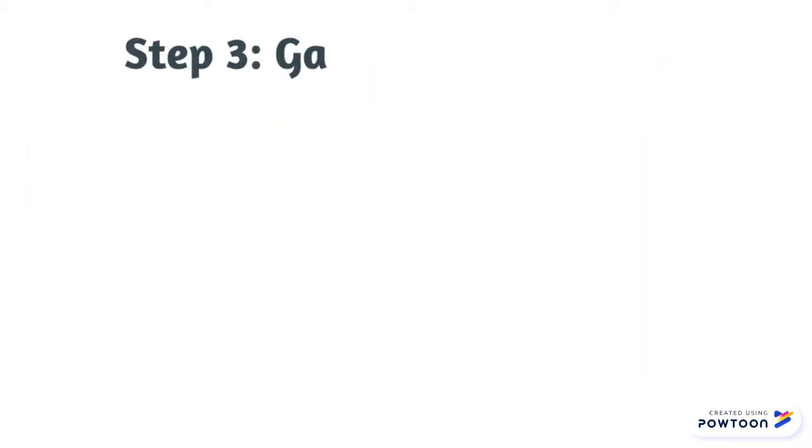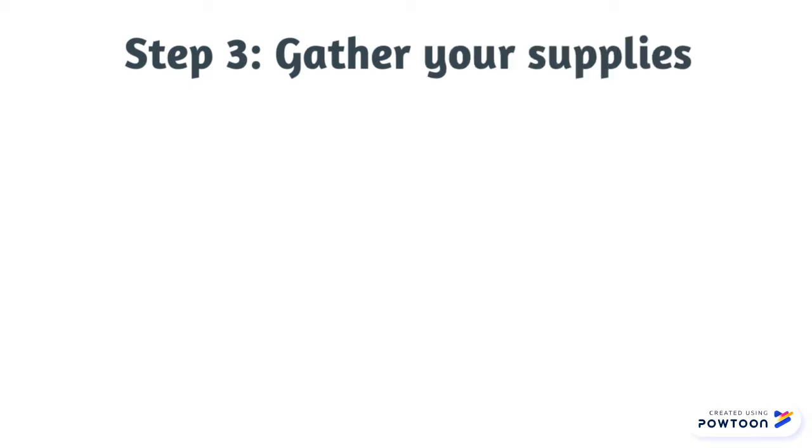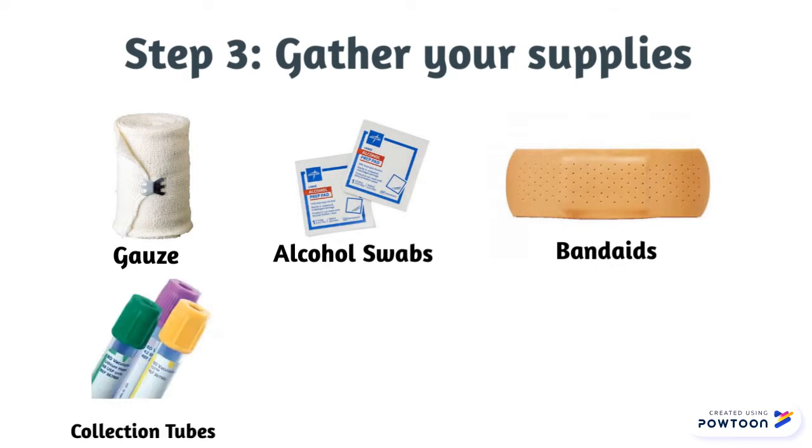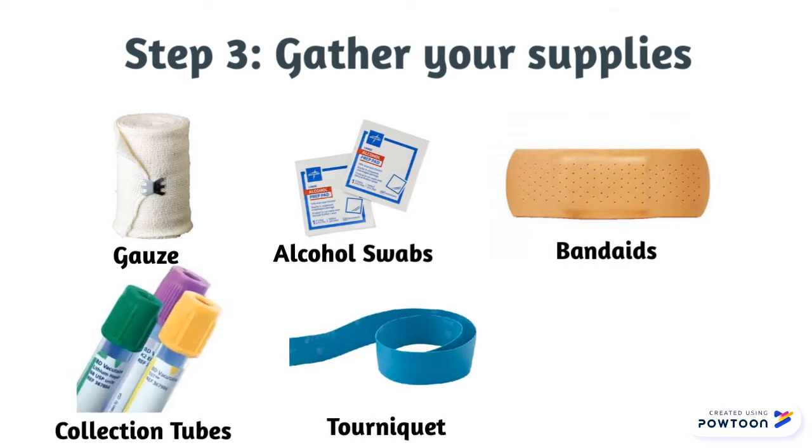The third step is to gather your supplies. This will include gauze pads, alcohol swabs, band-aids, collection tubes, a tourniquet, and the needle.